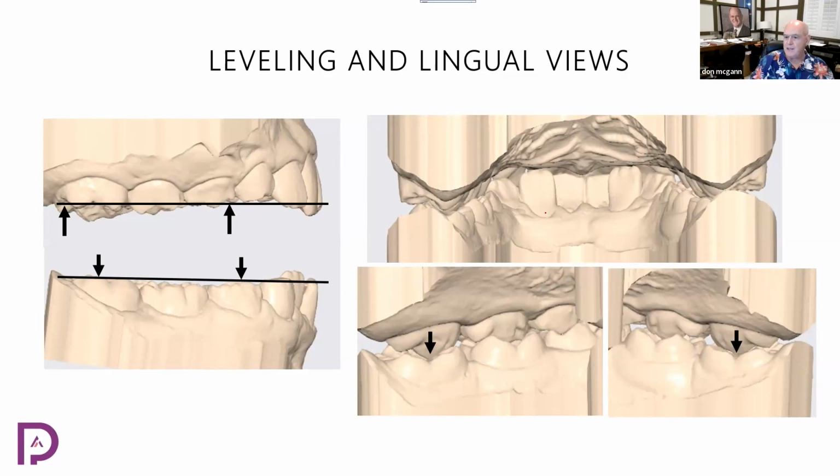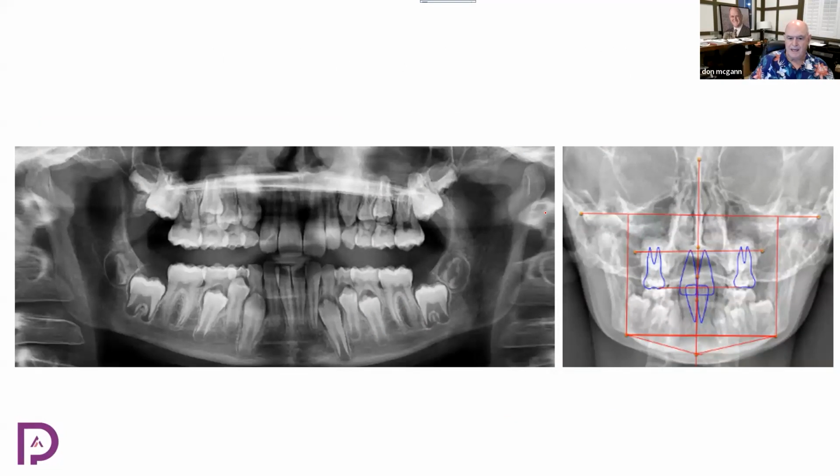Okay, so the most important thing here is that you recognize what a lingual class 1 looks like, okay? Because you're going to be looking for that all the time now that you know it, right? Okay, so the frontal ceph was good. How long do we have until full eruption? That to me looks like 2 years. Okay, looks like about half a root formation, maybe a little more. So probably about 2 years. So I'm going to plan 2 years.